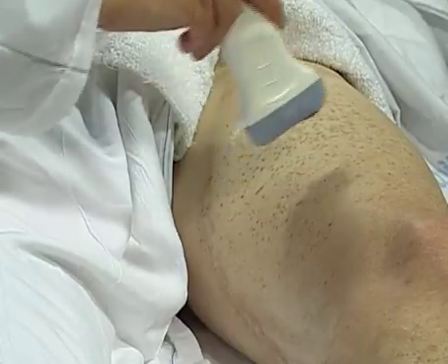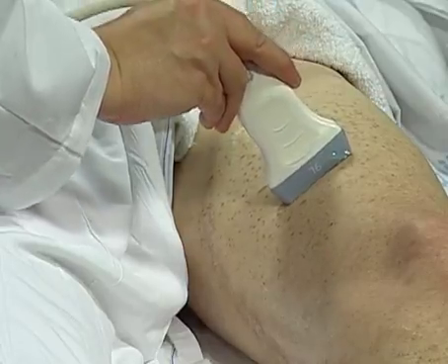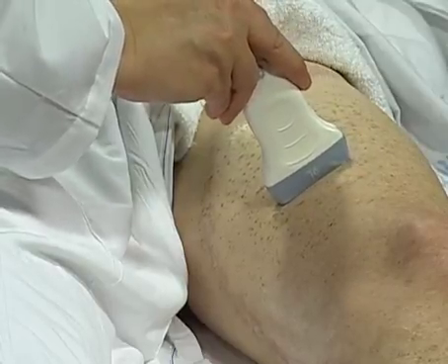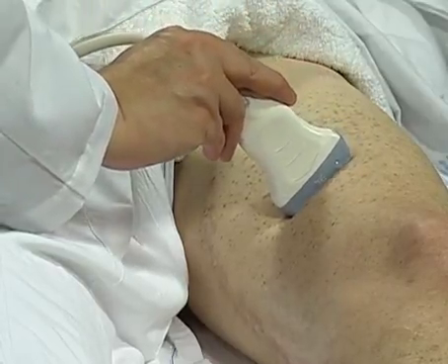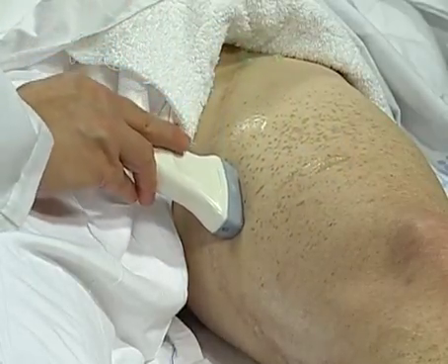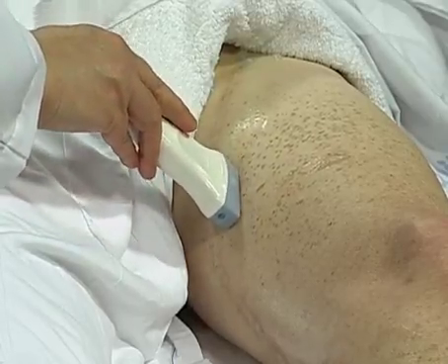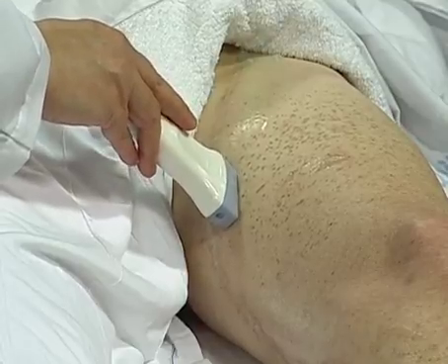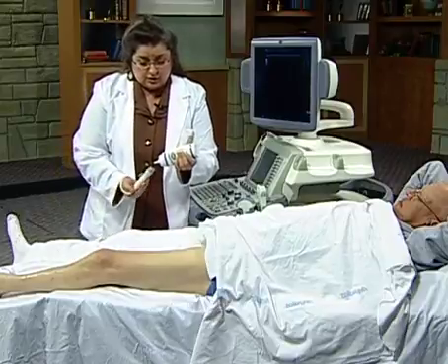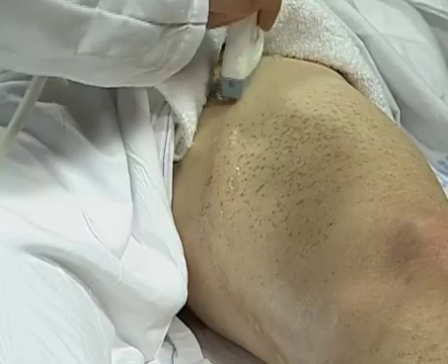I'm just going to show it in this direction, toward the leg, for purposes of the demonstration, but by toe heeling, I mean pushing in on one end of the transducer or the other to create an artificial angle to the vessel. So this bypass obviously runs along the leg in this fashion, so I'm going to maybe have to push in one way or the other to maintain a 60-degree angle. And I think that's important to learn how to do because you'll want to keep, again, close to 60 or certainly no more than 60. And by properly adjusting the transducer, you'll be able to do that.